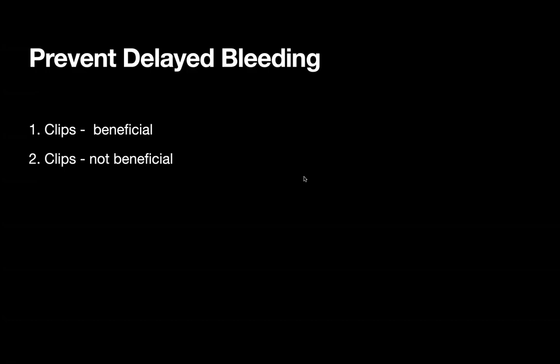It's also very interesting, when I was at UTMB, I did a lot of animal work on closing perforations. And when we looked at the colons of pigs after closing perforations, I could see the clip actually go almost full thickness closure. Because of that, when I came to Anderson, I was closing all my defects for the last 10 years.